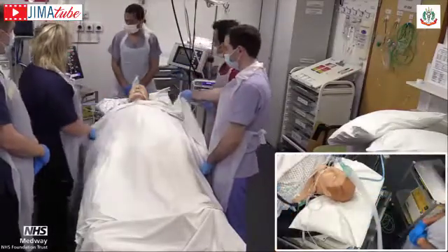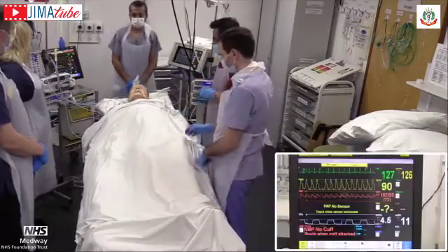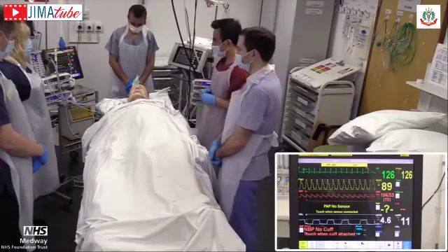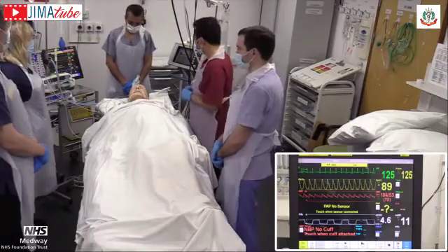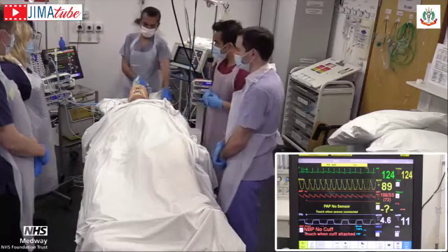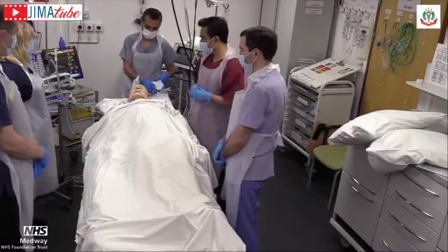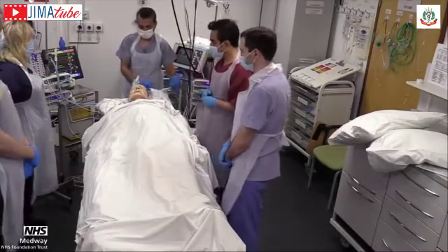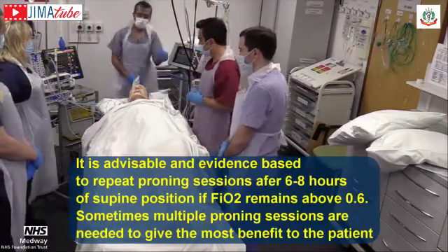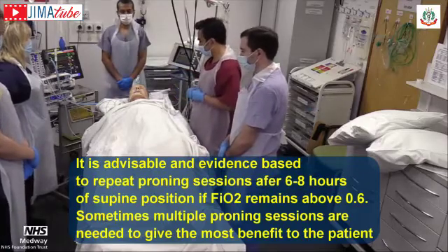He's on a sinus rhythm, tachycardic, as his oxygenation is good. He's got a CO2 trace quite nicely there, therefore his airway is in place. So nothing much has changed hugely. We need to keep a very close eye on his oxygenation for the next hour or so. Sometimes we do see very rapid deoxygenation after putting a patient on supine, and we should be prepared then to prone him again very quickly if that were to happen. So far he is stable, and we are very happy.